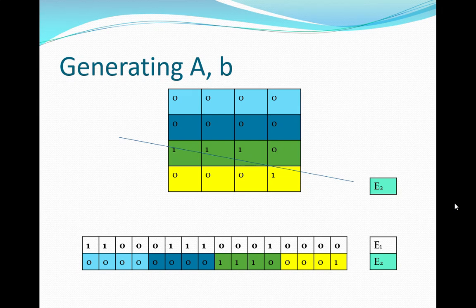As we stack them on, each row is a different proton, and that builds what we call the A matrix. Previous energy, new energy, as we stack these up, you get a vector, that's B, for AX equals B. But it's always the same X because of the relative positions, you're just saying, do I count that stopping power or not into this? Does that make sense?